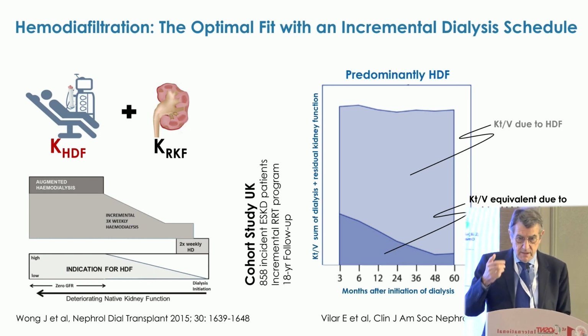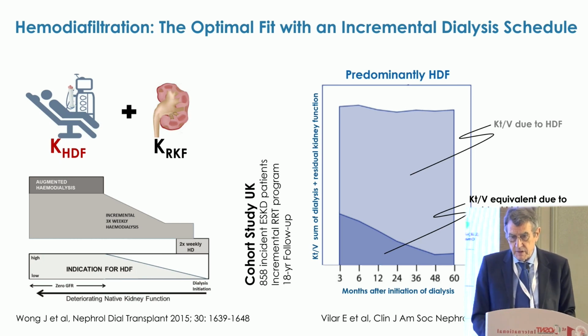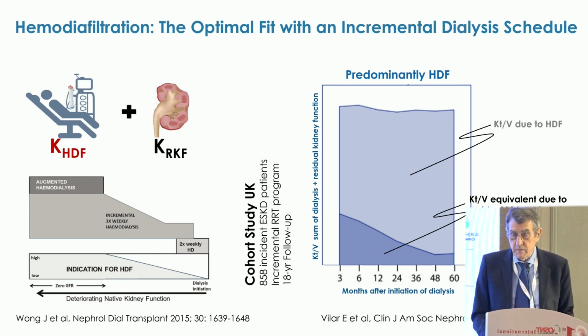And the point from my side, and I was interested to learn this morning about the Gulf result on the DOPPS. I don't understand why you are not interested to put incremental dialysis system, because that could be a nice opportunity, combining hemodiafiltration with a sort of residual kidney function, starting with once a week, twice a week, 3 times a week. This is done in UK, and you know that UK is leading this incremental concept with hemodiafiltration, showing that, again, if you put this in perspective, you can have a treatment time which is a little bit longer, less frequent treatment session, you can preserve the kidney function, and then at the end you can get better outcome.